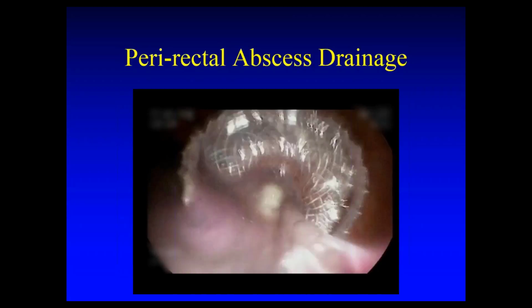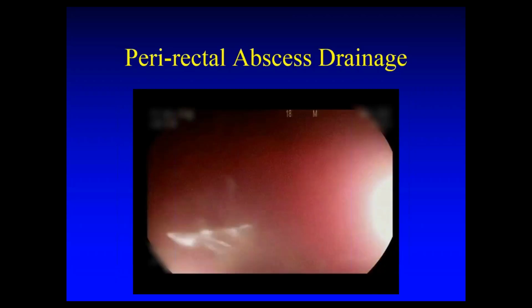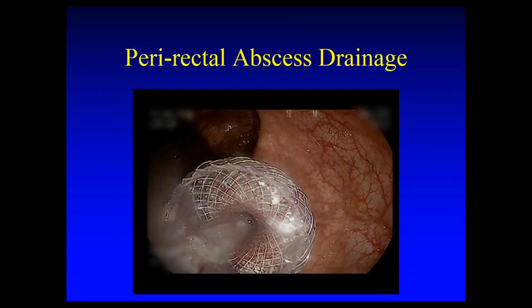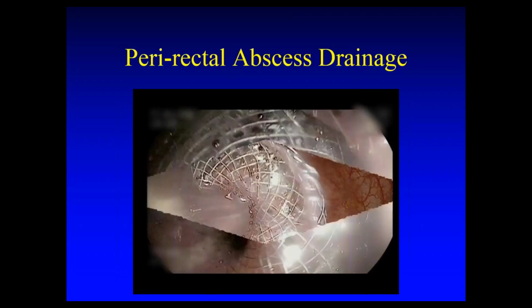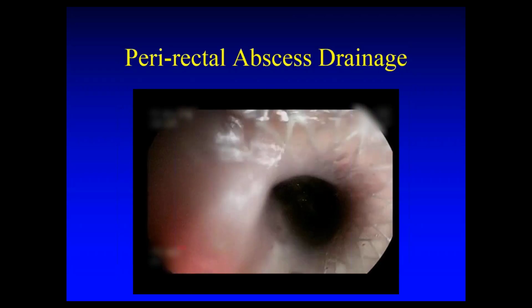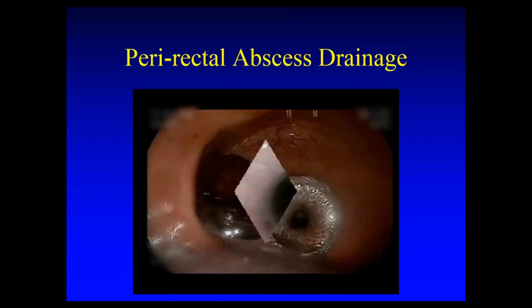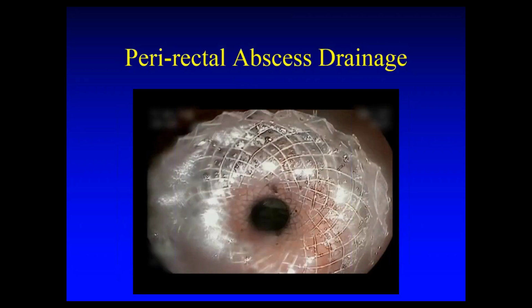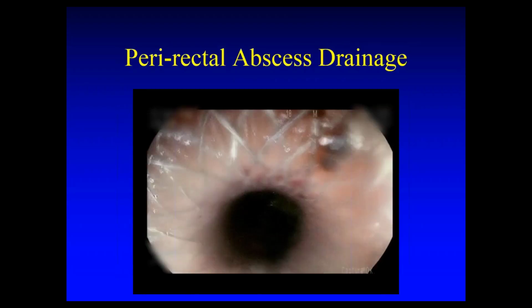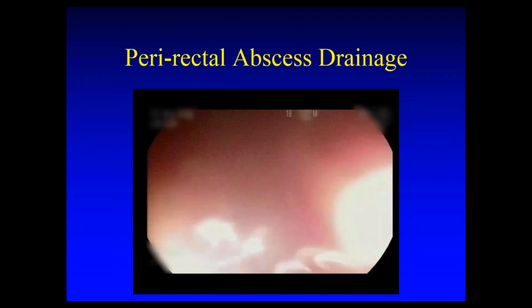Here you can see a lot of necrotic materials are emerging from the abscess cavity. You can go in a little bit just to see inside, but of course, with this case, there's no need to do any debridement because everything was draining so well. But I just wanted to look inside to see this abscess cavity. It's not something that you see every day.